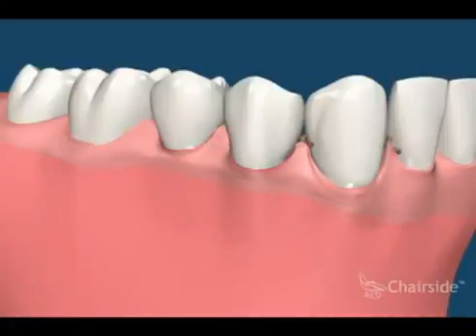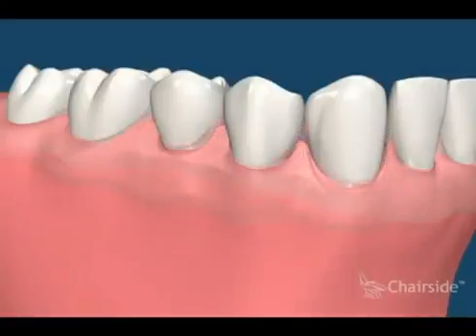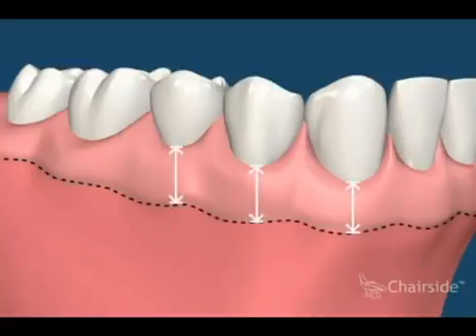The flap is then repositioned back on top, covering the graft completely and sutured into place. With time, the graft will promote the growth of new tough gum tissue, or attached gingiva, over the lost areas to the desired levels.